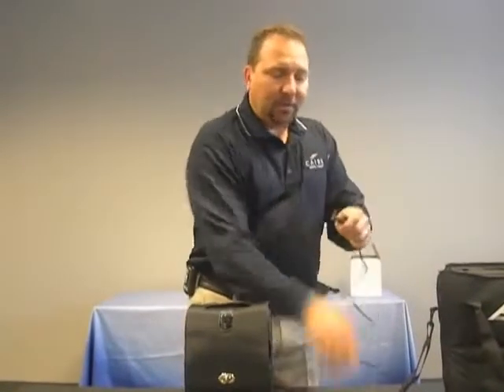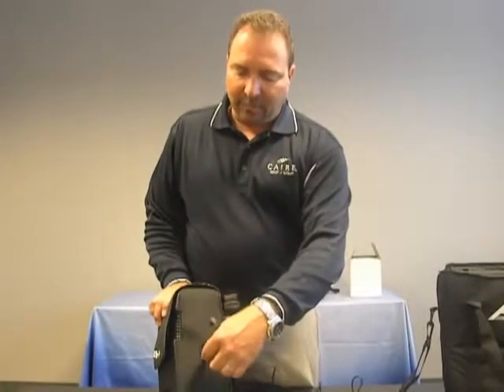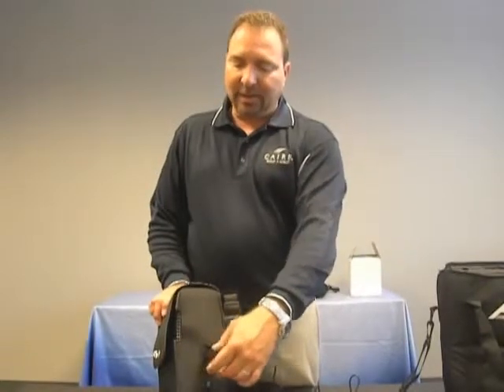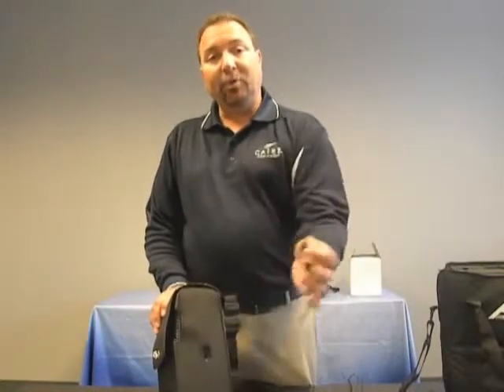Once connected, you can use the same port as the AC power supply by plugging the cord directly into the side with the fastener button at the top, pushing it directly in, making a secure connection. When you are finished using the DC power supply, you can remove the cord by simply depressing the button and pulling it out.